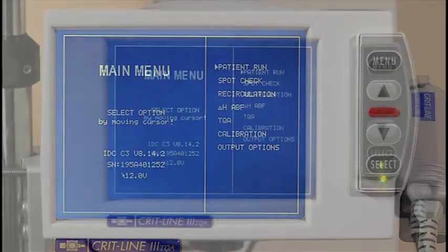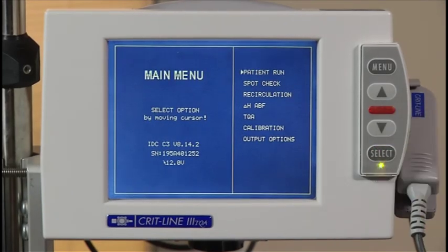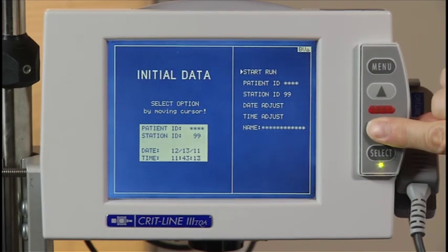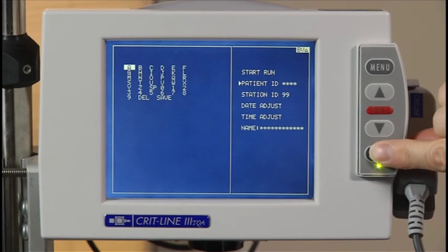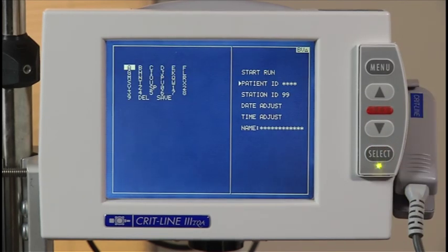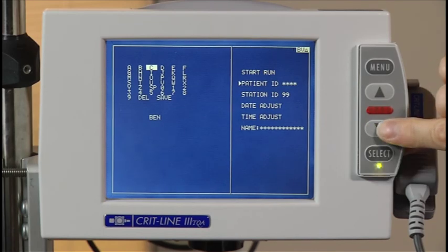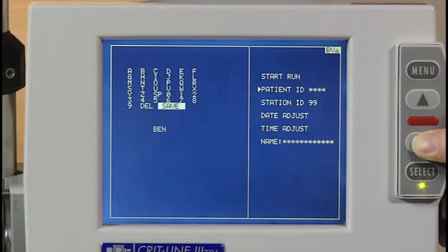From the main menu, move the cursor to patient run and press the select button to advance to the initial data screen. The initial data screen allows you to enter specific patient identification information prior to beginning a treatment. You can also verify the date and time in this screen and make any corrections as necessary. To enter a patient ID, scroll to patient ID and press the select button. You can then enter up to a four-digit alphanumeric ID number. Scroll to the letter or number you want and press the select button. Repeat this process until you have entered four digits. If your patient ID is less than four digits, scroll to save and press the select button.